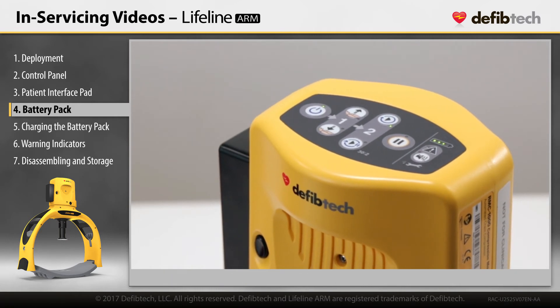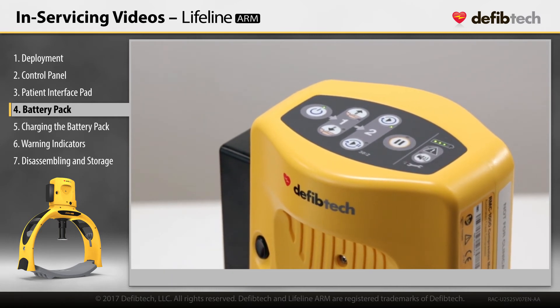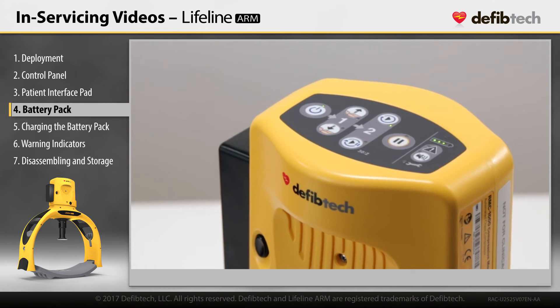By design, swapping a battery pack can be quick with minimal interruption. If changing the battery pack took less than 15 seconds, the device will remember the set start position.